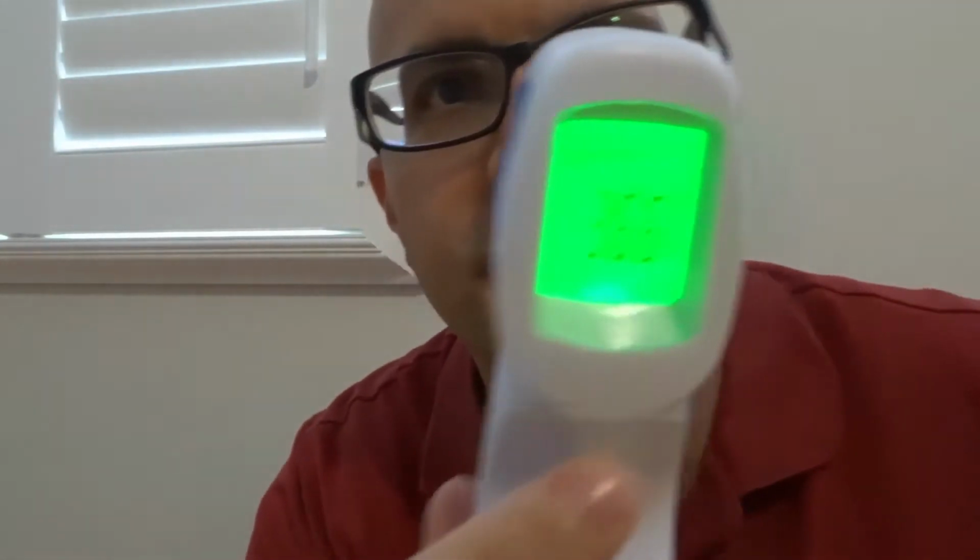Okay. And what we want to do is we want to make sure that we place it relatively, sorry about that, once again, my foot keeps hitting the tripod. You want to place it a few inches from your head, just like that. And you want to click it to measure it. As you can see, 36.6, I don't know if you can see this. So that's normal, I would say. It all depends on your own temperature, and that's 36.6 degrees Celsius.